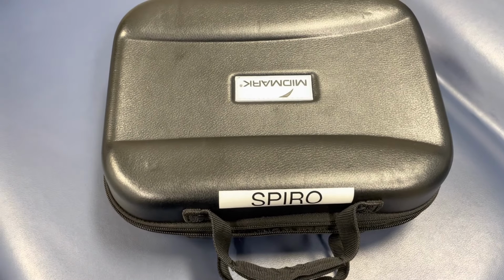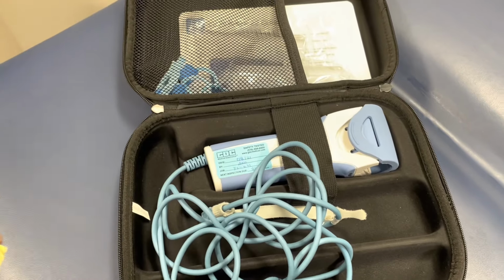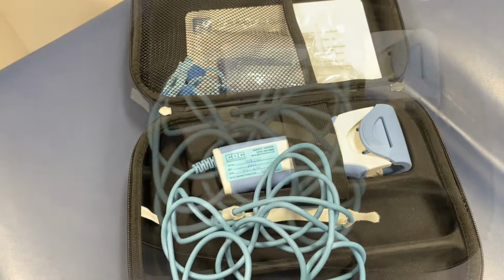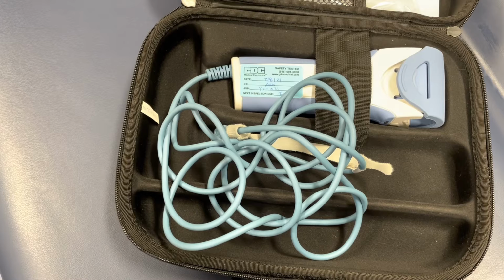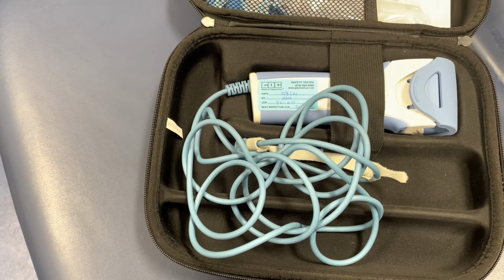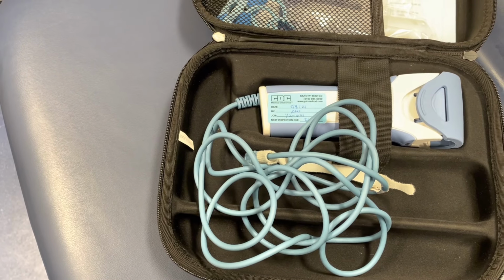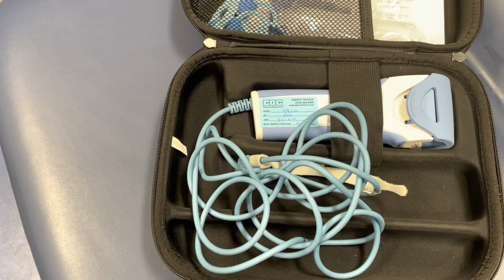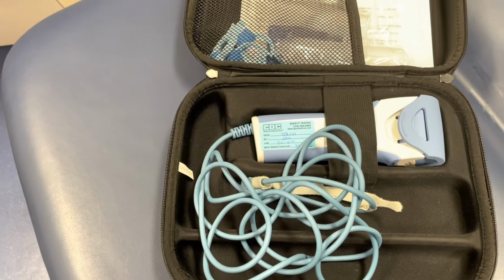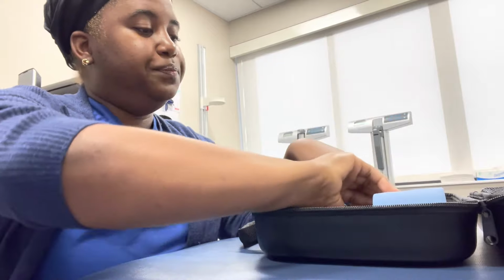Okay, you guys, so this is what we use for the spirometry test. For short, we say spiro. The spirometry test is a test that measures how much air you can breathe in and out of your lungs. It is used on patients that have shortness of breath, wheezing, or asthma.